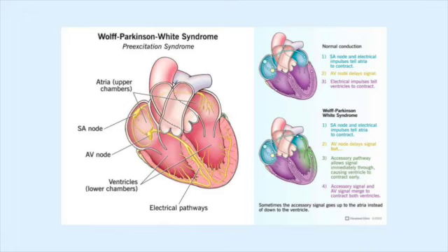So WPW, Wolff-Parkinson-White. Particularly in the field, why this is important to us is that if it is something we're going to treat, meaning the tachycardia that we're going to treat that's symptomatic, we probably don't want to be treating with a calcium channel blocker. We want to withhold that diltiazem. So that's the clinical relevance of being able to identify WPW. Delta wave, right? Right, and usually people know they have it.